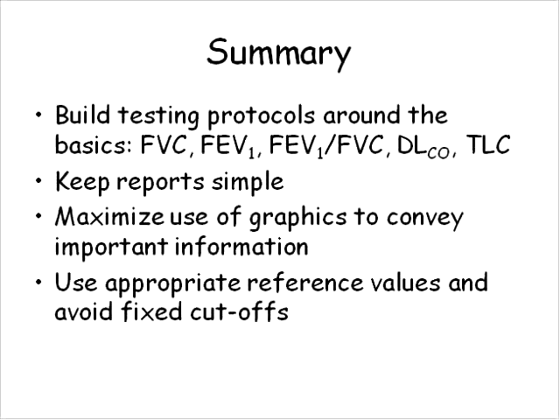There was a question related to any tips on the best way to coach patients to do maneuvers to obtain the best results. Excellent question. Unfortunately, that's a question that many folks, even people with some experience in doing spirometry, tend to overlook. And I think the key ingredient is to make sure that the patient takes a big breath in before they do the maximal forced exhalation.